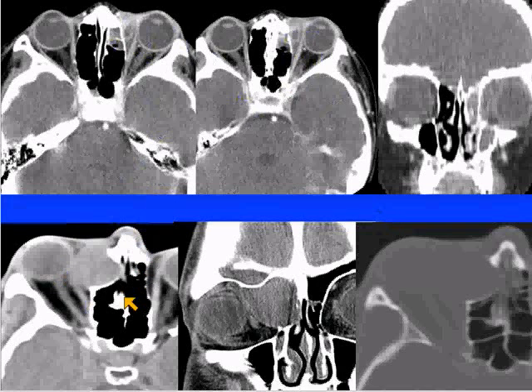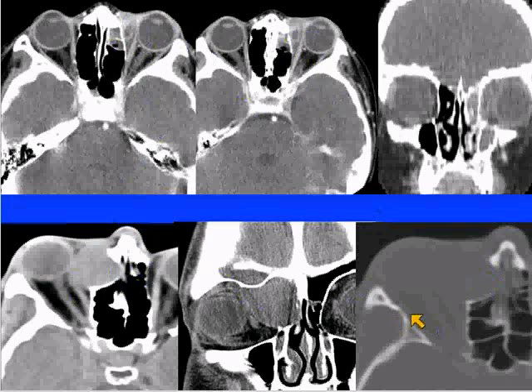Often the medial rectus muscle will be displaced, and you can see inflammatory changes along the extraconal fat. This is a patient with a frontoethmoidal mucocele — this is the ethmoidal component. You can see that the walls are thinned out and bulging into the medial canthal region. Mucoceles are secondary to obstruction of the drainage pathway and can be fluid-filled. The key is to see thinning of the bone, with the center within the anterior ethmoid air cell.